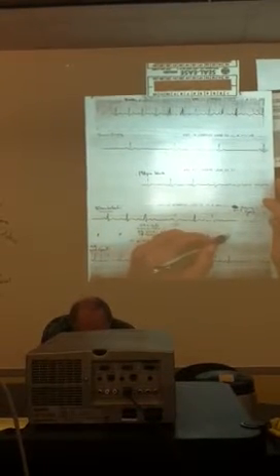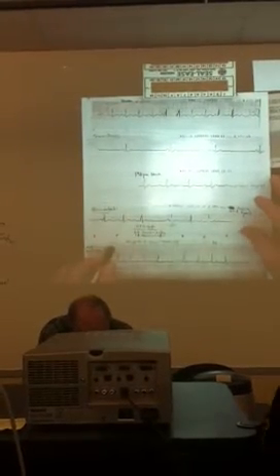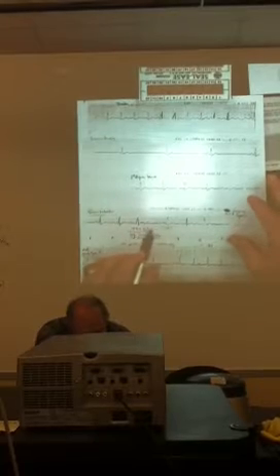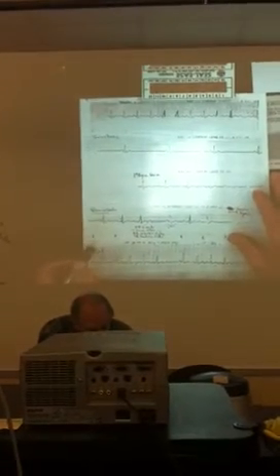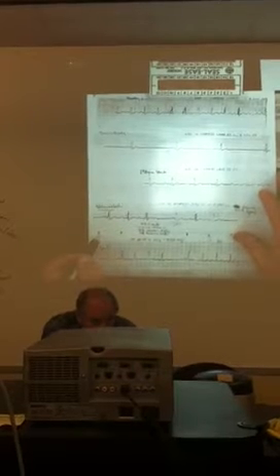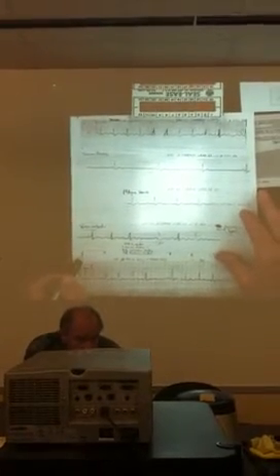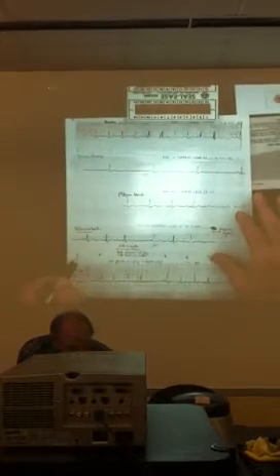All right, there we go. 1, 2, 3, 4, 5, 6. You count the number of R peaks in a 6-second interval and multiply by what to get a minute? What do you think? 10. Good job.